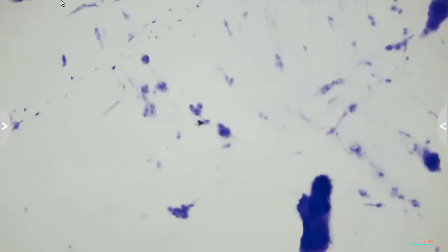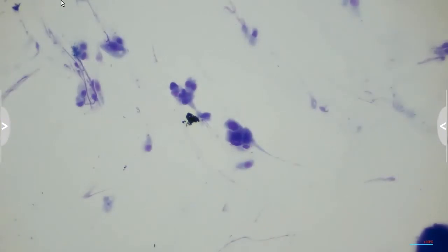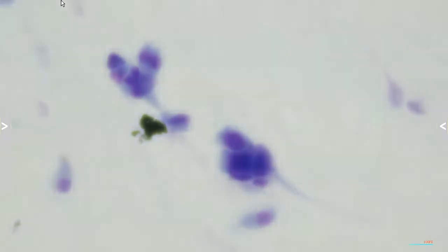Excellent. Maybe we just need to refocus a little. Excellent. So as you can see, dysmorphic cells with irregular and enlarged nuclei, which means that we're definitely in the correct area when we're taking these biopsies. To get the final diagnosis, obviously we'll have to wait for the pathology report for the specimens placed in formalin, but definitely it looks like we're in the right place.